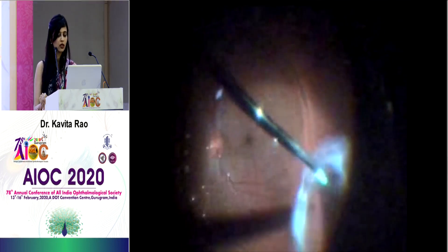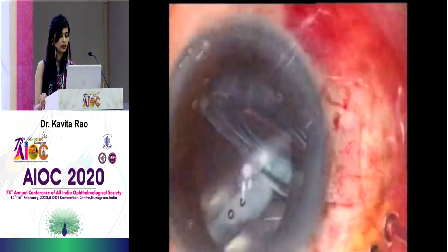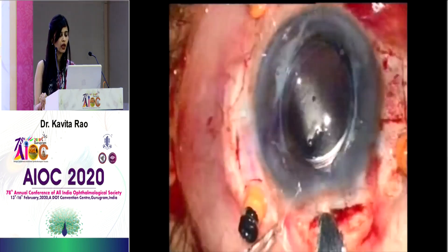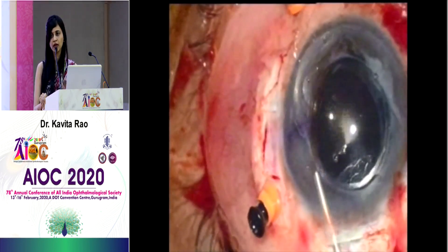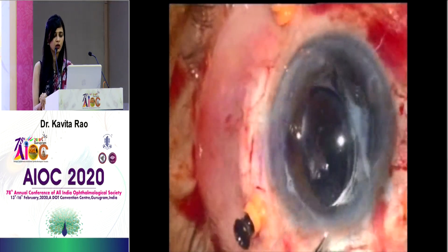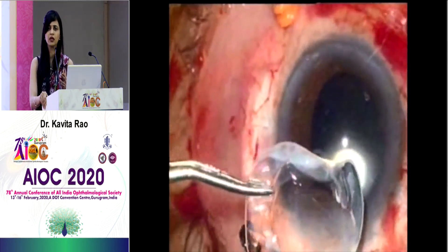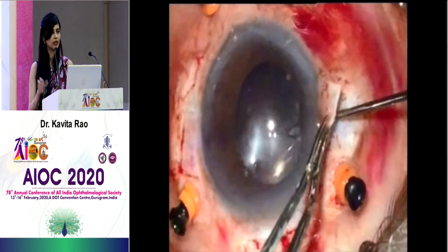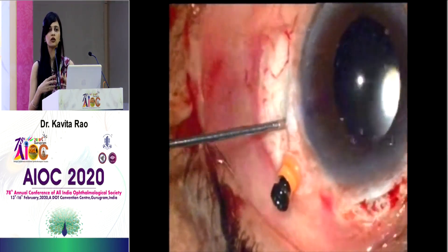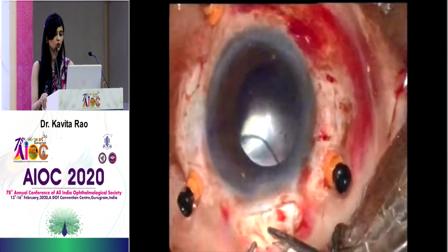As you can see, it's actually a one-piece IOL with the entire bag, which was delivered anteriorly by the surgeon. If it were a three-piece IOL, the same IOL could potentially be glued. However, a word of caution: the IOL has been in the eye for many years. In a similar case we tried glueing the same three-piece IOL, but the haptics were very malleable and twisted, so that could be a factor against reusing the old IOL.